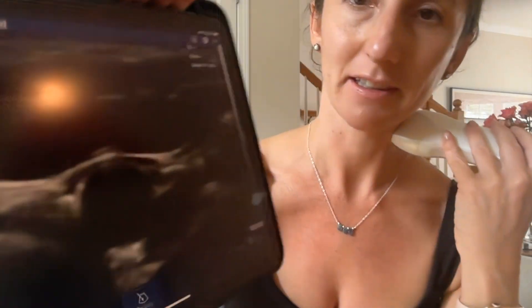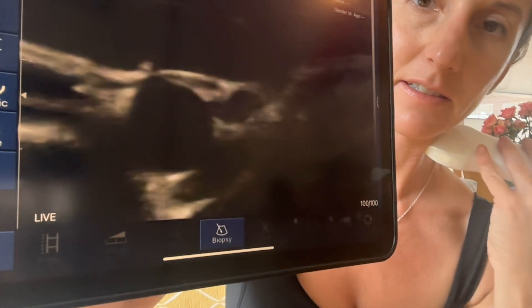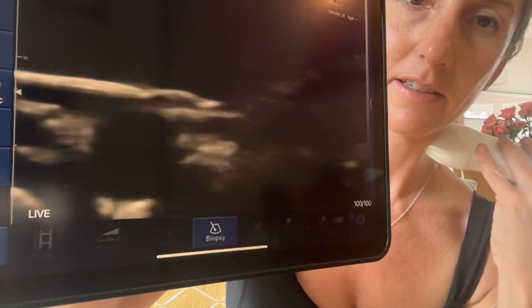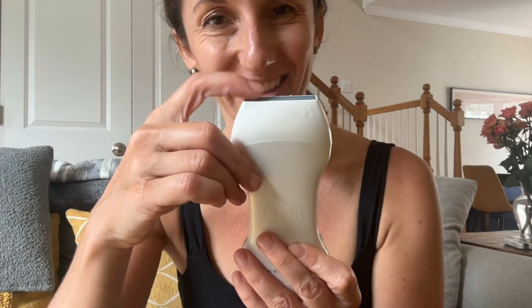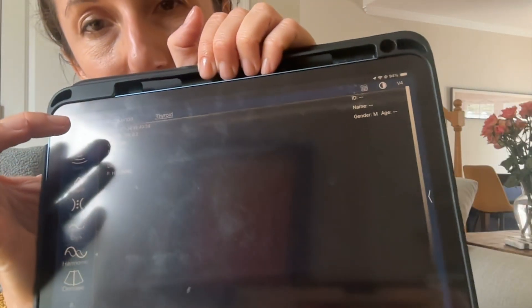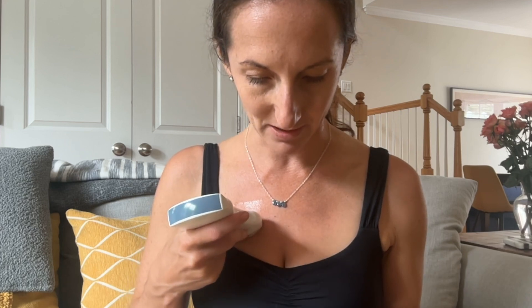I've put some gel on my probe and we're taking a look. Let's look for the carotid and the IJ, and you can see it showing us right there. It has this little line here, and when you tap on it, this is going to be the same place as the little green indicator, so you can orient yourself. Let's use our linear probe to look at some lung and some pleura.